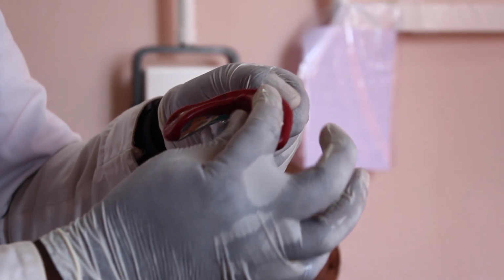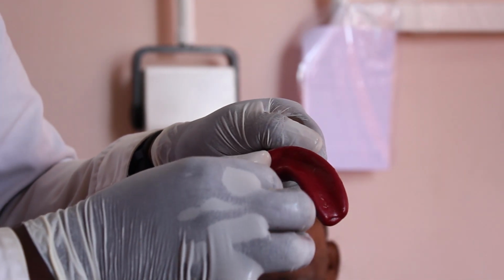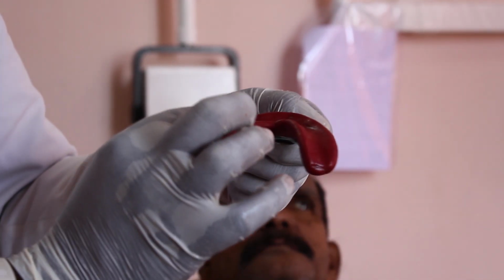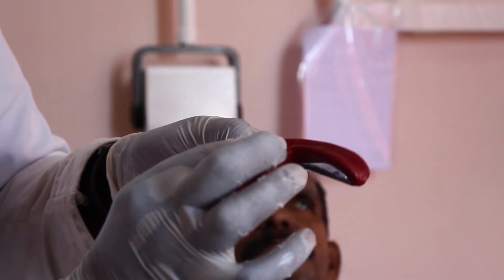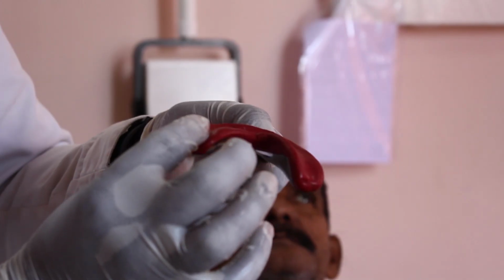Now we are going to make the impression for the mandible. So I am adapting the impression compound over the selected impression tray. I am slightly pre-molding it for better flow and as well as for a better impression.